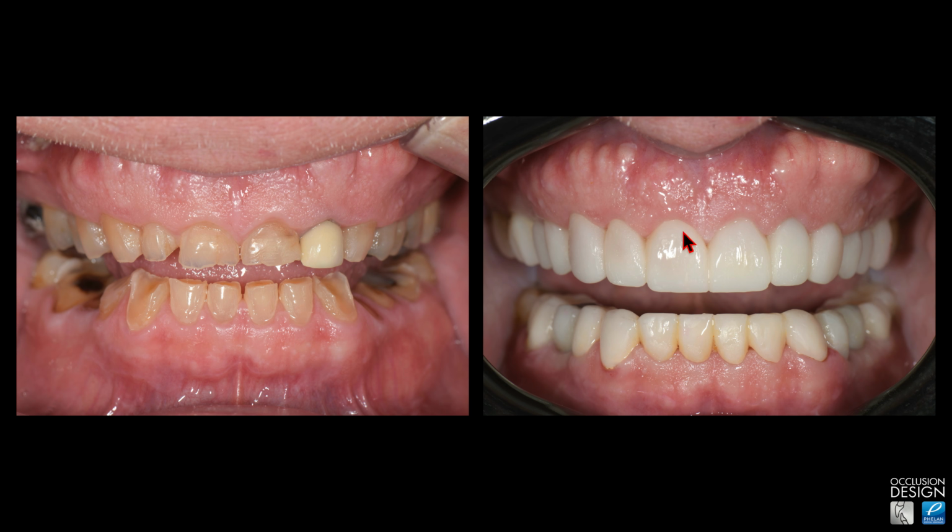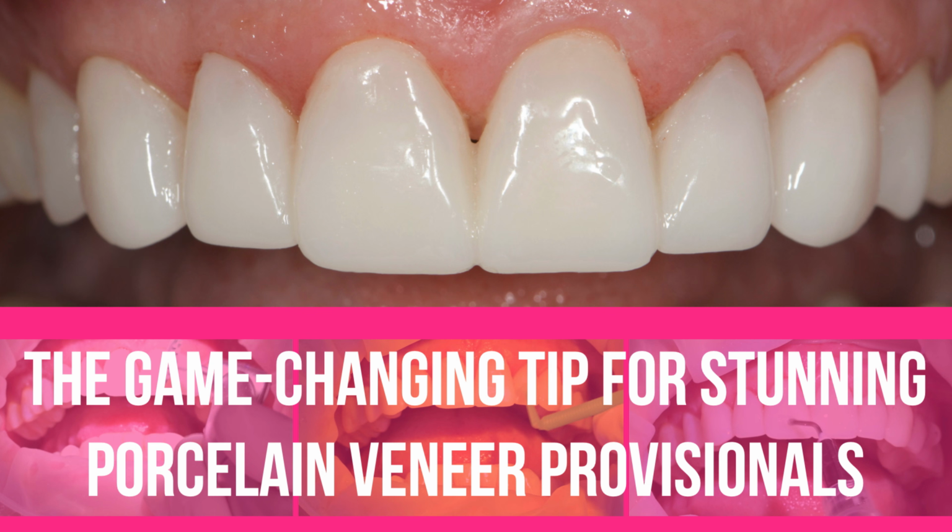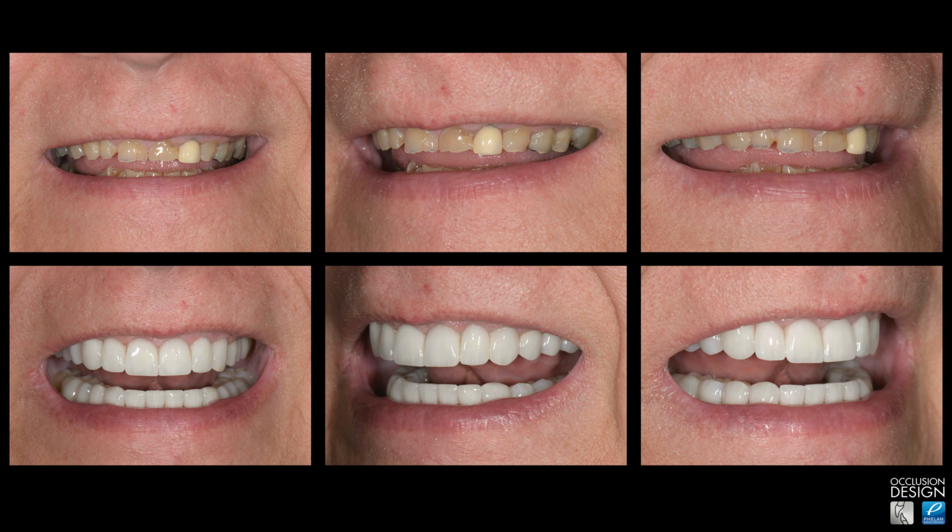But this finish, this super luster to the provisionals, I get that with a product called Glisten. You can look at my last video to see how we apply that and some good tips to make that even better. And now I'll just jump to the finals because I don't want this video to be too long, but here's the before and after, upper and lower.